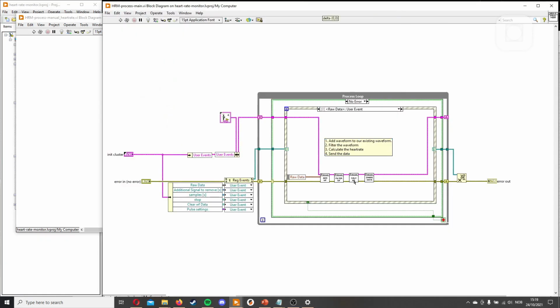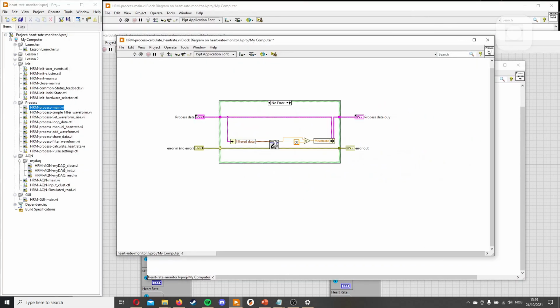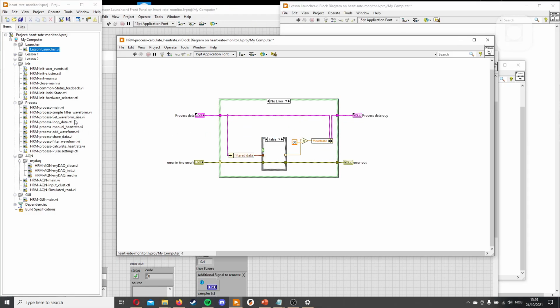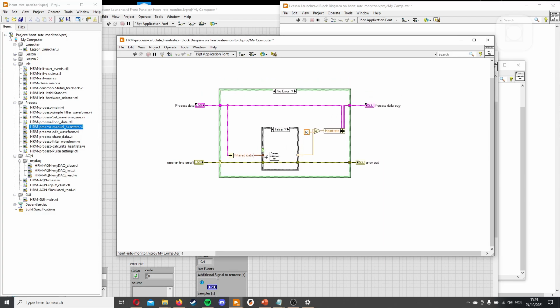Now we want to add it into the calculate waveform here. This is getting a bit messy. What we'll do is to cover this one in a case. Let's place the function in here. And let's make a little bit more space. We have a lot of space. And we want this in here. And we put our waveform in here. We get our frequency out, which gets calculated, and then we need our extra functions. The manual there.